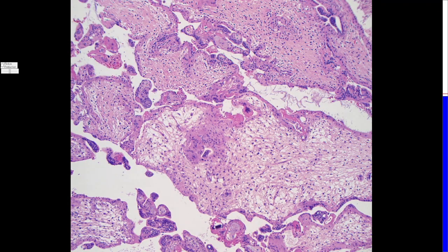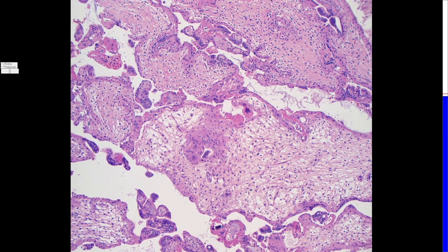And then we have trophoblast inclusions and pseudo-inclusions. This is an example here. So what's the difference between trophoblast inclusions and pseudo-inclusions? Pseudo-inclusions are supposed to be just tangential cuts of the irregular villus outlines. And real inclusions are believed to occur because there is true trophoblast proliferation. So you see this area here, it looks like the trophoblast is growing in. And here we have maybe a pseudo-inclusion right there.